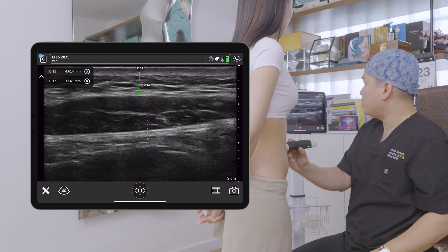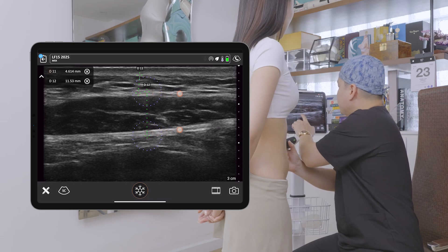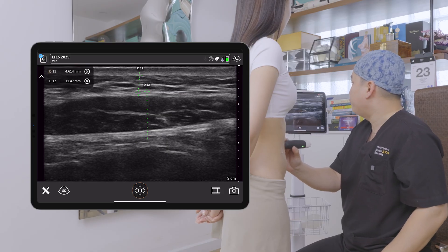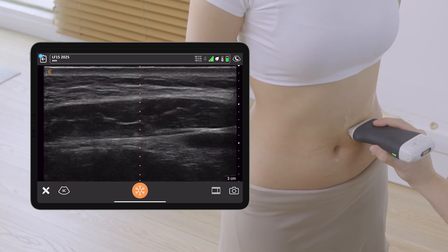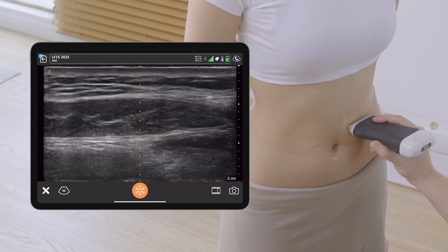For the rectus muscle measurement, I try to include the anterior sheath as well as the posterior sheath. You can see that this patient doesn't have a lot of fat at this level and has a very thick rectus muscle. This is also a chance for me to engage the patient and show her what we are both seeing.